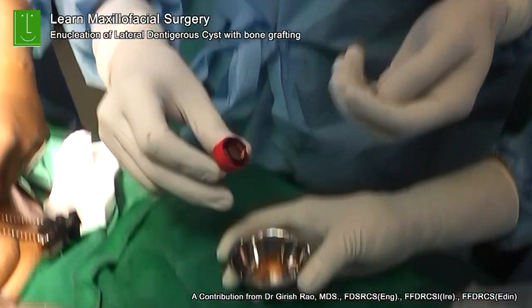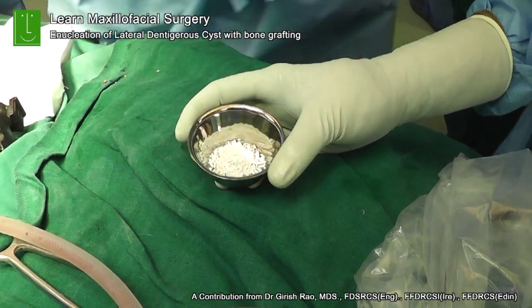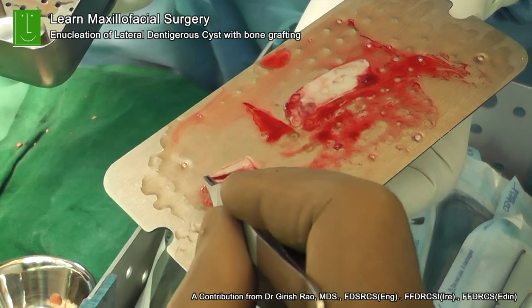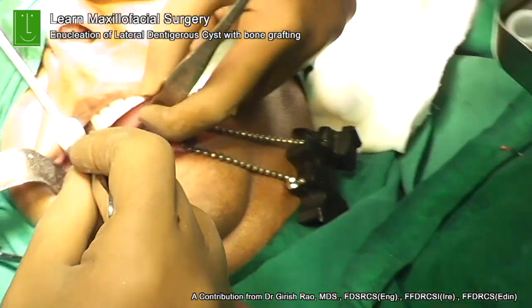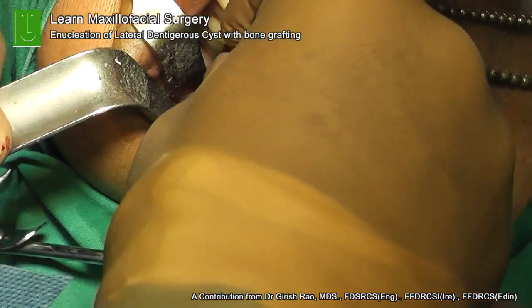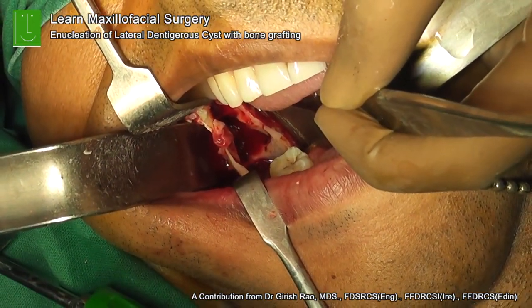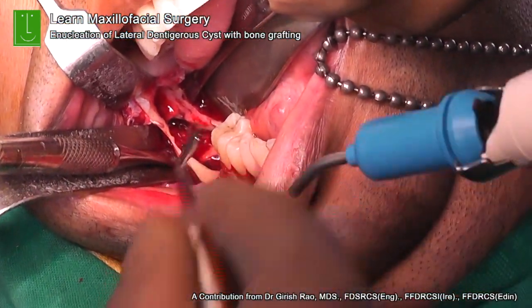Bone grafts, you have a whole choice of graft materials. You can use alloplastic materials, or you can use xenografts, or you can use even the gold standard autogenous grafts too. For small cysts, it's a good idea not to use autogenous materials. You have plenty of synthetic materials which you can mix with PRF and PRP, and that's very good. This is a PRF which we are putting at the base of the cyst cavity, and where the perforation was there, just above the inferior alveolar nerve, so that it basically helps in healing. So that's like a base.